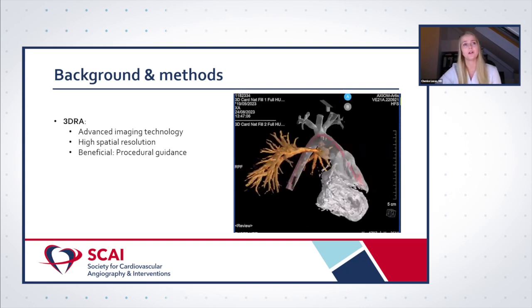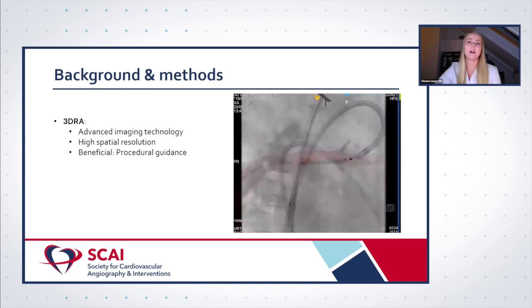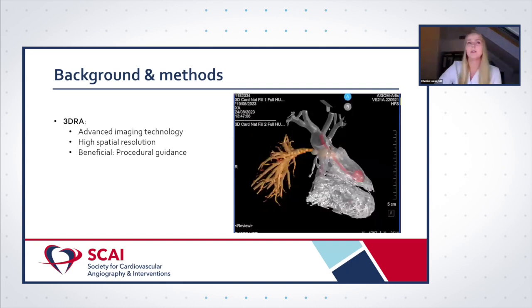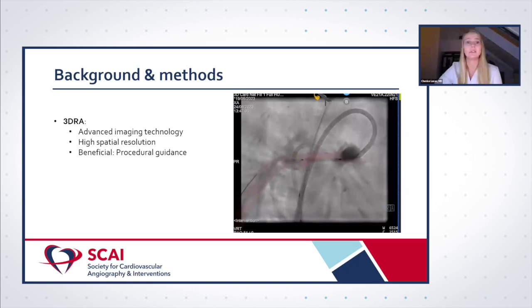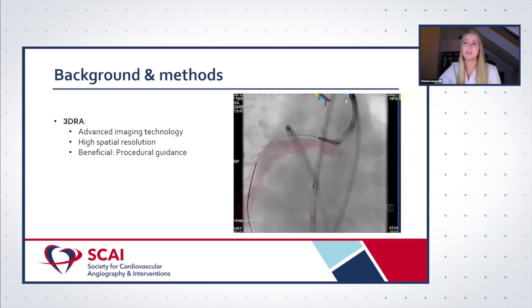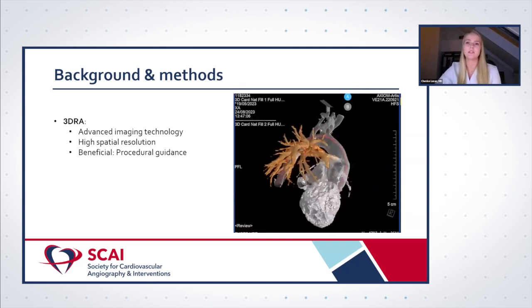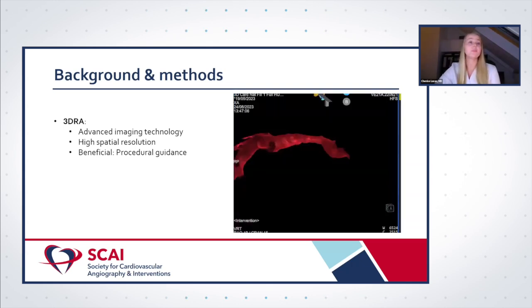This data set offers high spatial resolution and takes tissue characteristics of different Hounsfield unit ranges into account. 3D-RA allows for unrestricted virtual angulation of the target lesion or region of interest, which is usually not achievable when using regular biplane angiography. Particularly beneficial is that advanced guidance of interventional procedures is facilitated by back projection of the 3D image as a 3D roadmap on the conventional angiographic system.